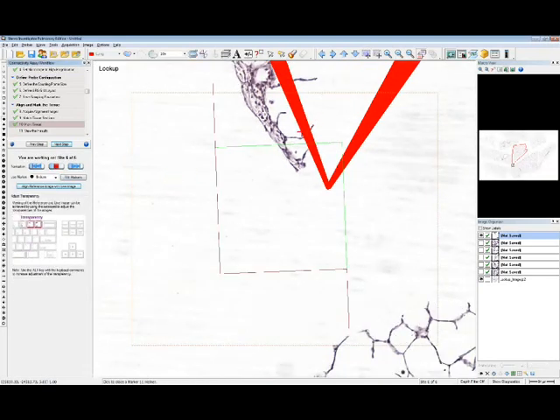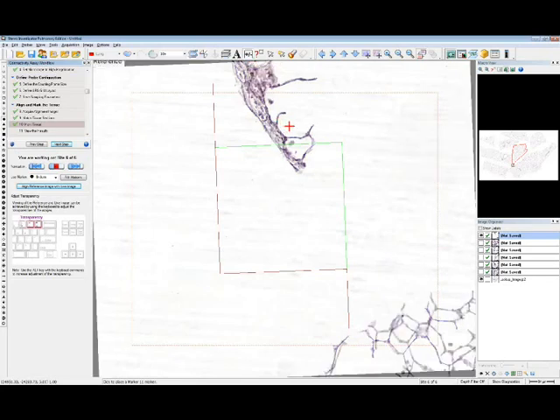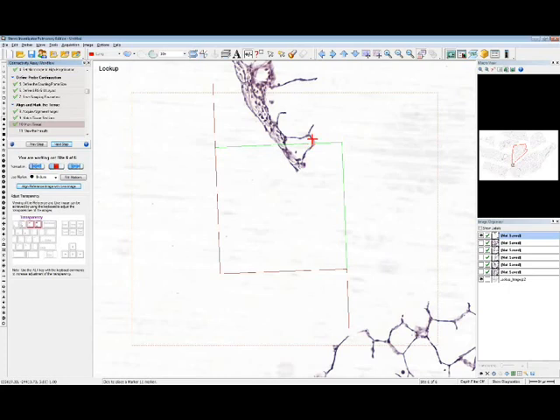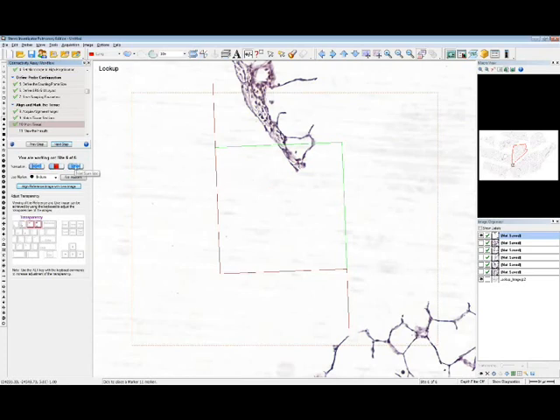And you can see there's actually nothing here. You can also see that I can't really see behind this red line here really well. So what I'll do is I will shut off the thickness of the line, hide the line altogether, and let's change the transparency so it's not in my way as much. But we can see that we had a bridge in the lookup, but no bridge at reference. And again, we're only counting from lookup to reference, so we'll not be counting this one right now.